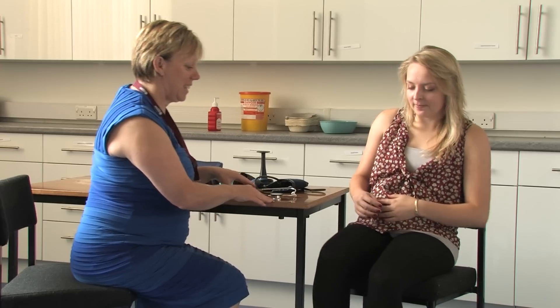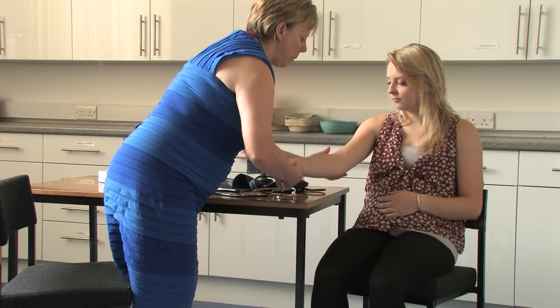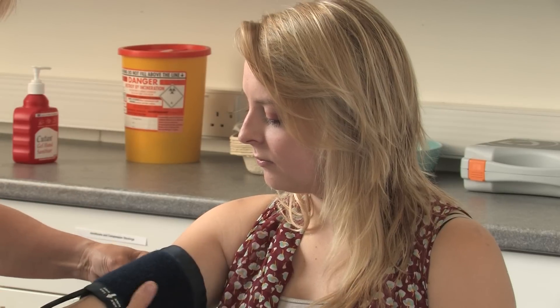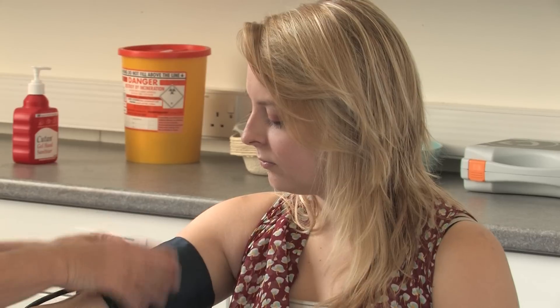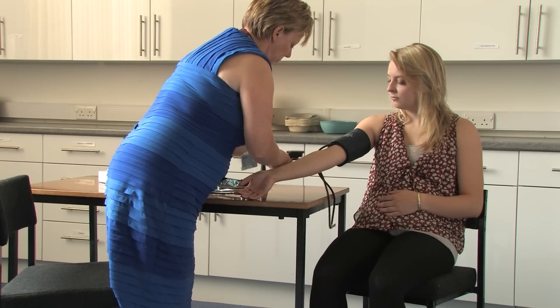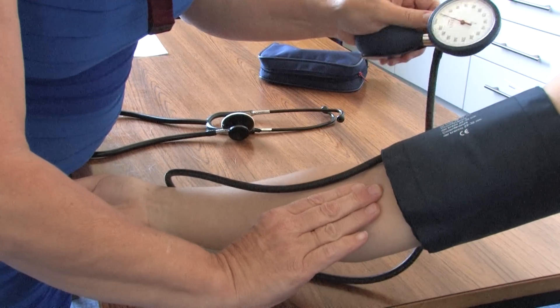Explain to the woman what you are going to do and gain her consent. The woman should have her legs uncrossed and ensure that her arm is exposed without any clothing constricting the arm. Then wrap the cuff around her upper arm, two to three centimeters above the site where you palpated the brachial pulse. The cuff should be placed centrally so that the pressure is distributed centrally when the cuff is inflated.